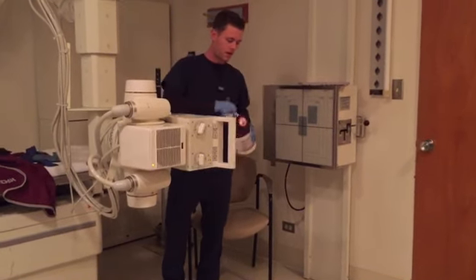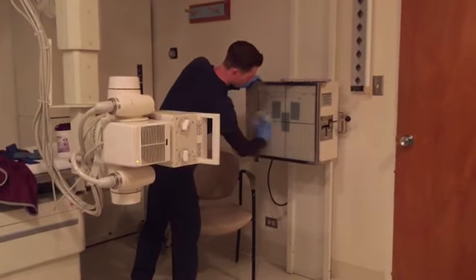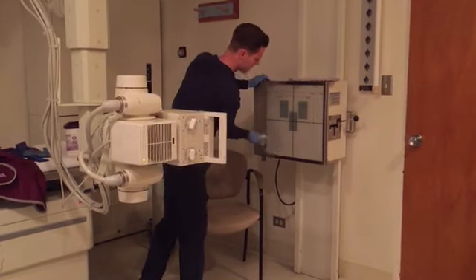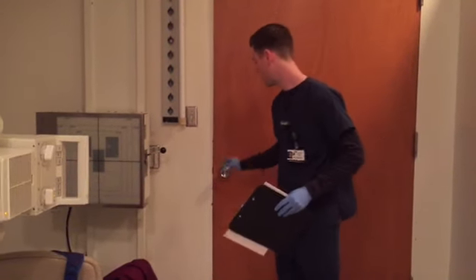And we're going to go ahead and wipe down the bucky as well, because the patient's going to be placing their face against it. And besides that, I'm ready to get my patient. Alright, now that I've set up the room, it's all ready to go. I'm going to go ahead and get my patient now.